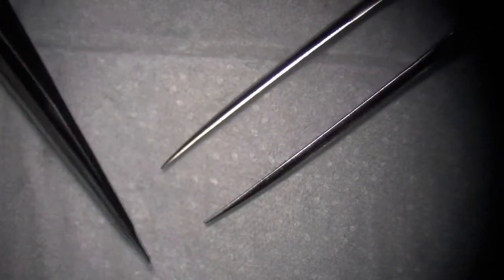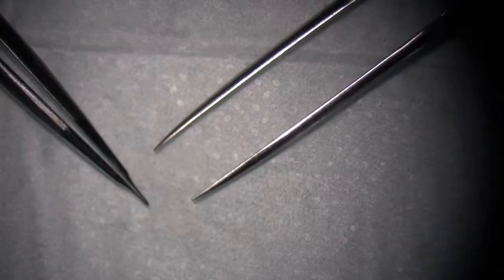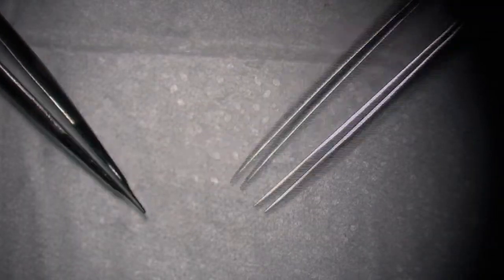So this is the dilator. We use the dilator when we dissect the vessel out, cut it, and irrigate it, and it's exposed to room temperature. The smooth muscle tends to contract, to close. So before we do the anastomosis, we put a dilator in there to make it go back to the normal size.